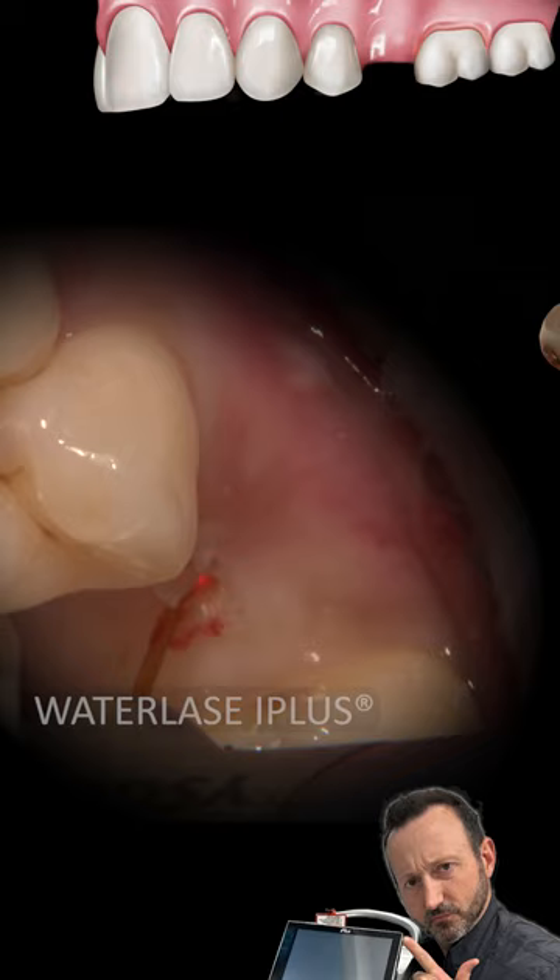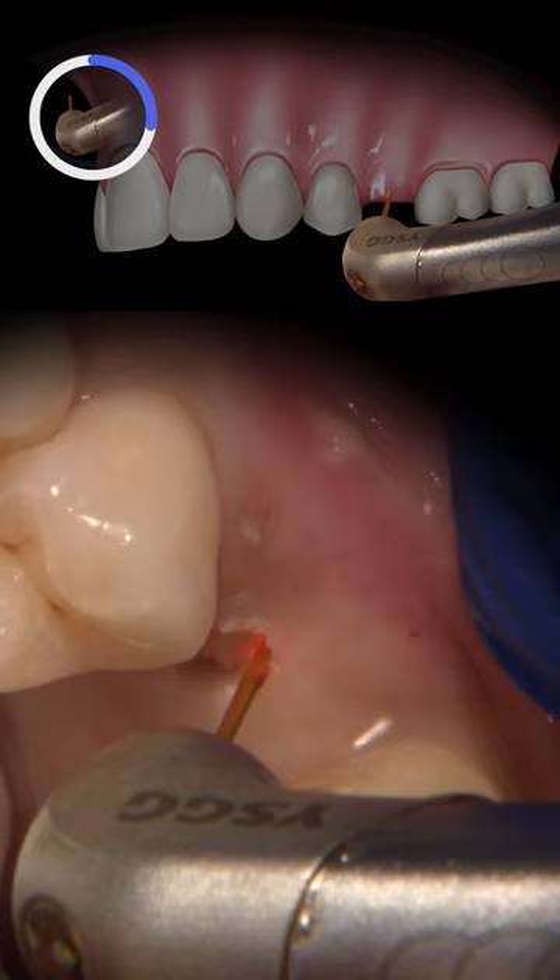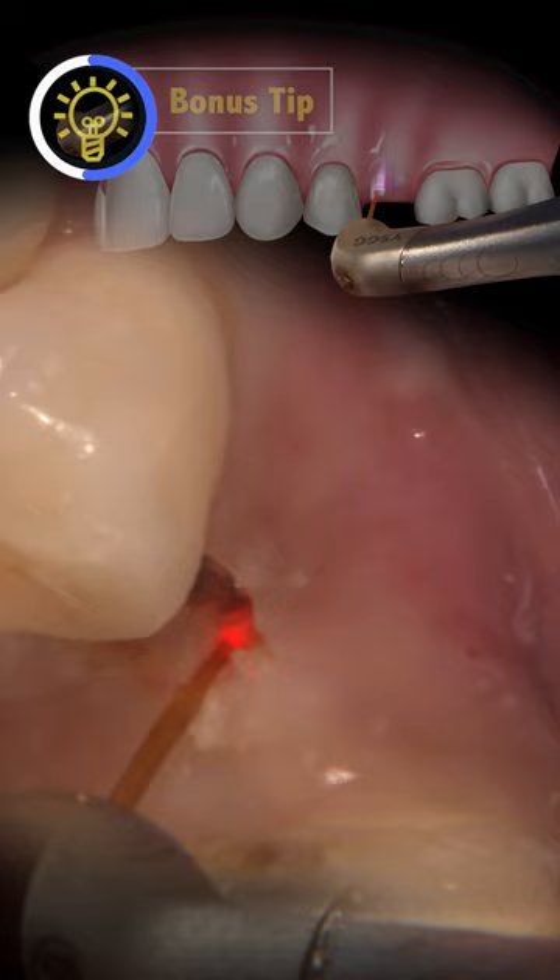In areas where there is ample keratinized tissue, like in this situation, I am going to use the laser to remove the tissue that is covering the implant, instead of displacing the tissue to the sides.